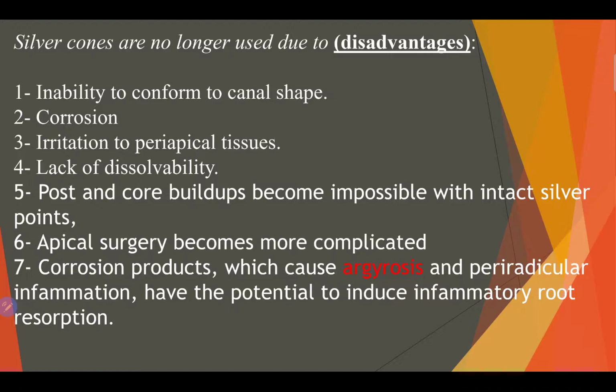When you see a previously treated tooth with a silver cone, which is very rare to see now, I saw one once when I was a student, when you retreat this tooth, you don't see a cone, you will just see corrosion product, like a stain on the walls of the root canal, and then it degenerates and makes a periapical lesion due to inadequate or bad technique of obturation and inadequate hermetic seal, like we said before in the beginning of the obturation.